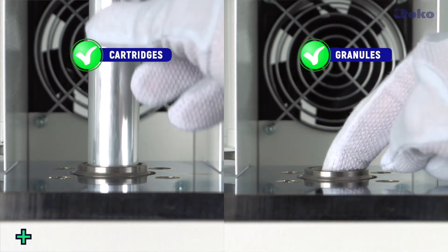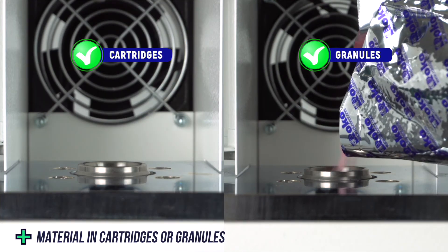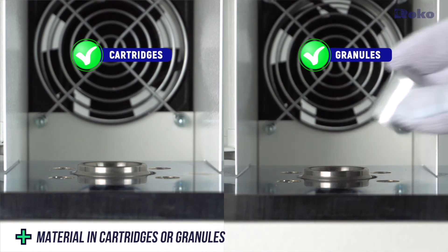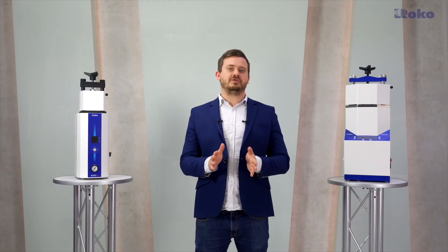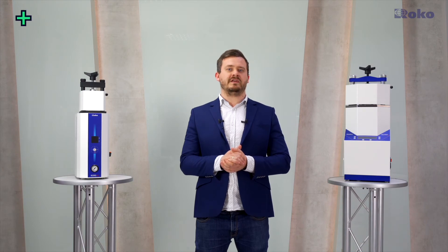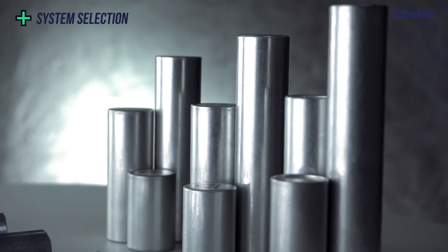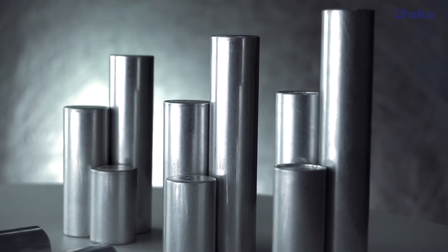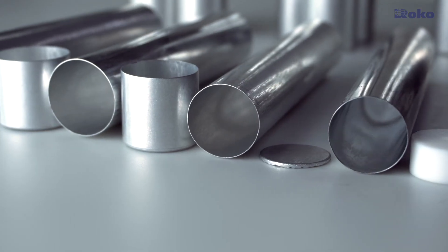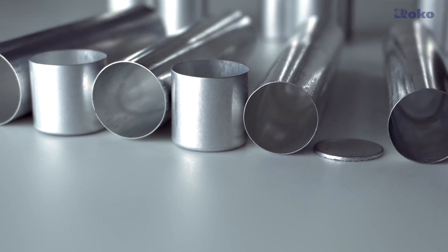When using the Multipress injection machine, you can use the convenient integrated cartridges or pour the material into the sleeves yourself. Roko produces cartridges for all systems, so you can choose the one that works best for your lab. Multipress is available for one inch, 24 millimeter, or 22 millimeter diameter cartridges. In Roko technology, the choice is always yours.